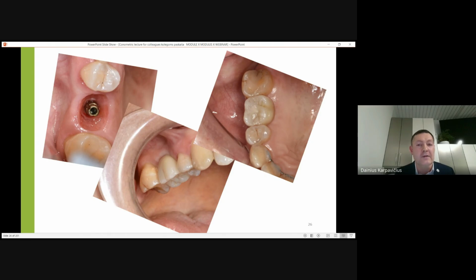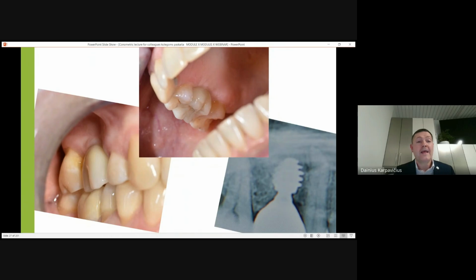It's not necessary for us because there is our abutment with about 5 degrees of cone. We close it. It's a very good seal of this part. Bacteria cannot enter this tight connection, and that is why bone is very happy and is quite often above the implant. And later on, we're working just on the level of soft tissues. This case is about 2 years after.